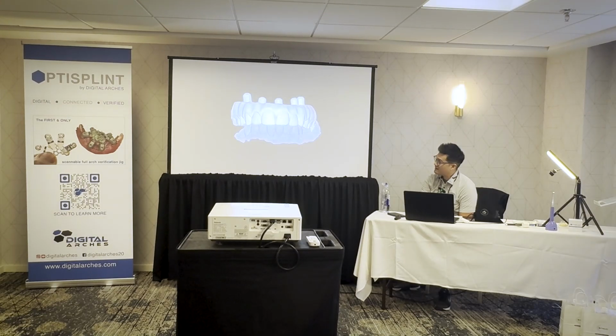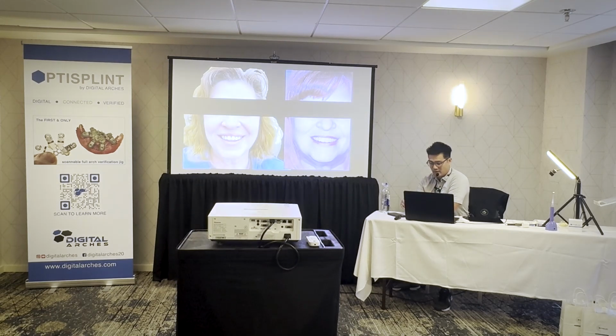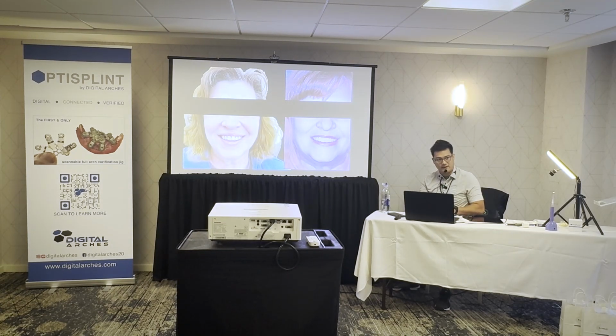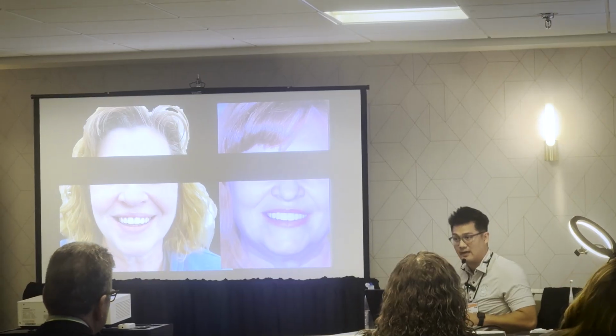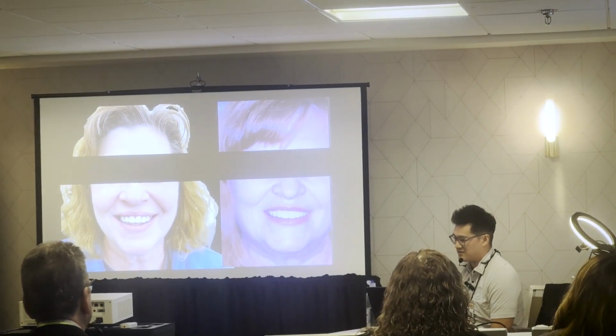So now I've got everything I need. Okay, right? I've got my temporary 360 scan. I've got my OPTISPLINT in the mouth. I scan it outside the mouth. Finish the case. And then we go to final. So it's a case where, again, in one appointment, I did scan the tissue to make sure I got the tissue. We did do a smile design to verify tooth shape, incisal length, midline, all those things.